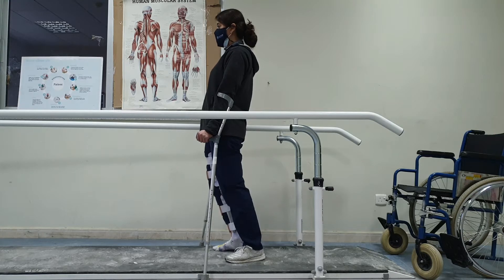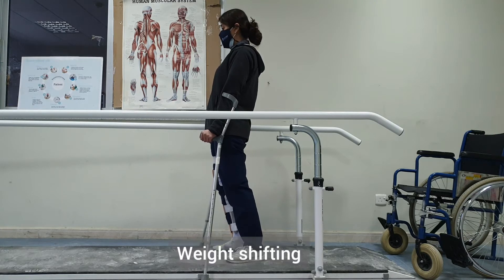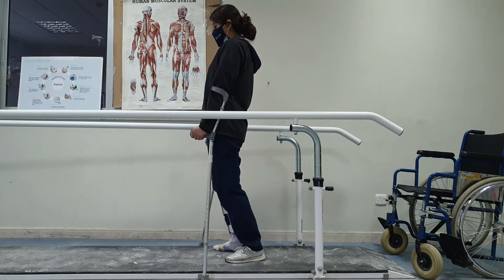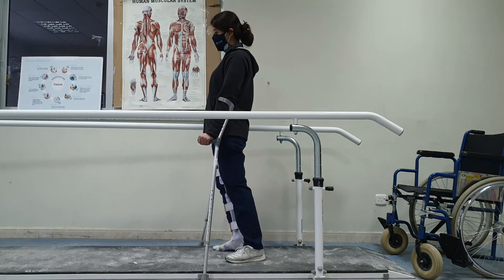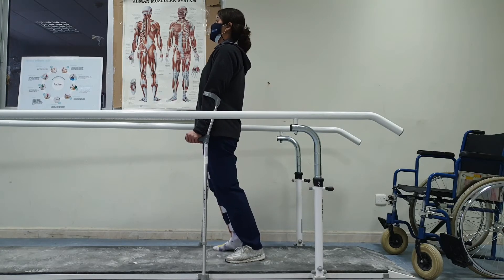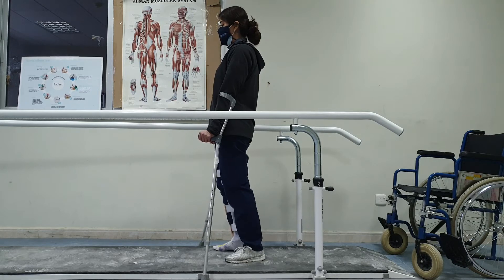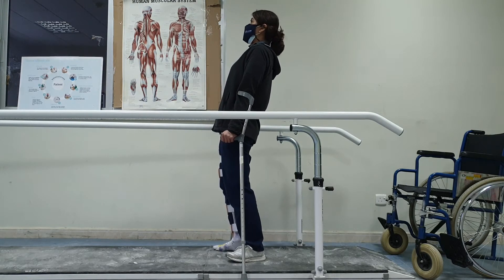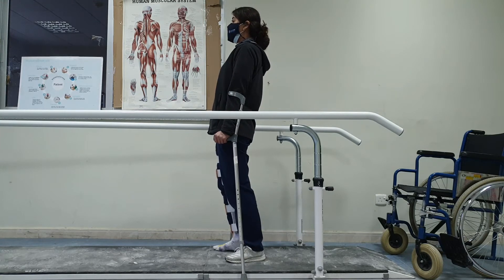Next we will do weight shifting — sideways, and then forward and backward. Especially with forward weight shifting, we need to pay attention and prevent jackknifing from happening, because the patient may not have hip extensors and could lose balance and fall forward.